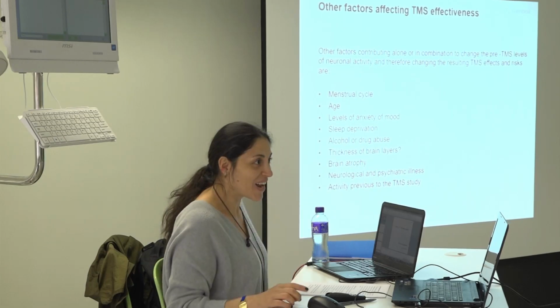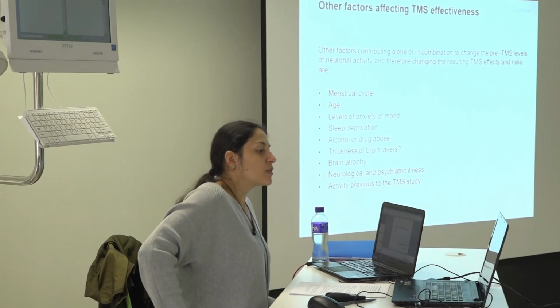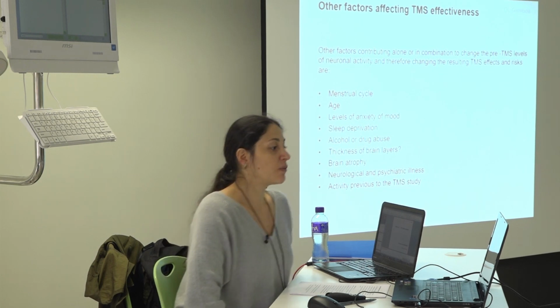So thickness of brain layers, I put a question mark because how can you measure that, right? But definitely it affects. We talked before about that, right? There are some models that you can check. Some groups are working on that, so it's a factor, definitely it will affect TMS effectiveness.